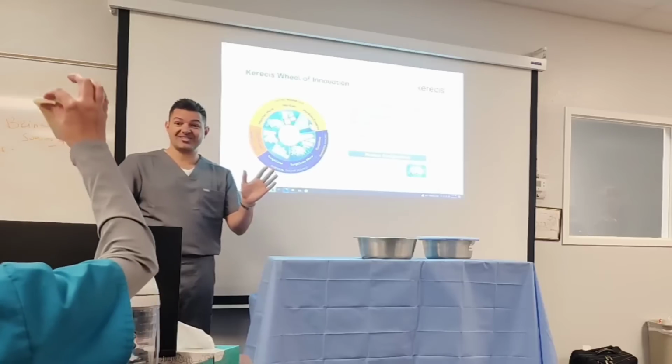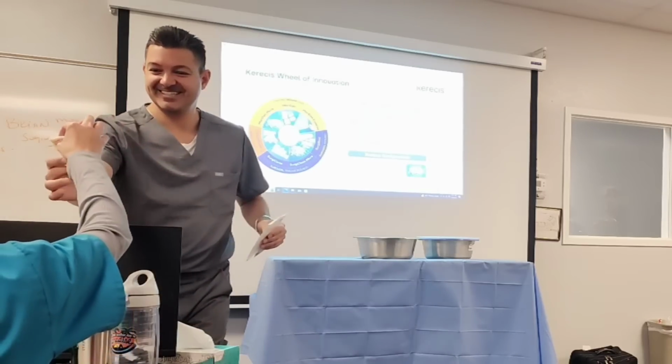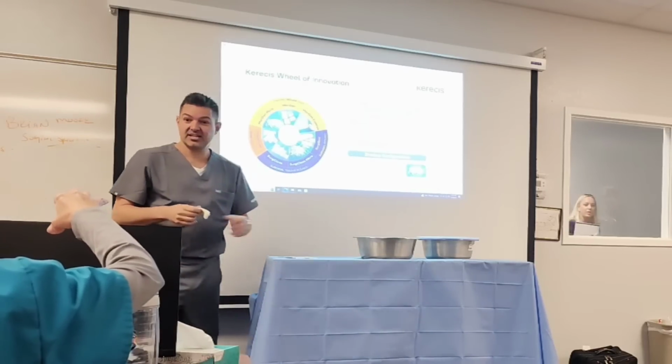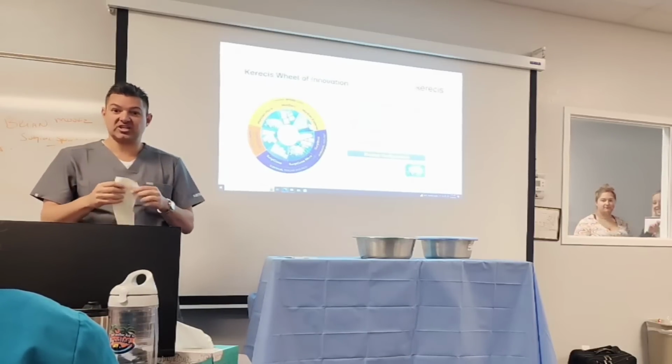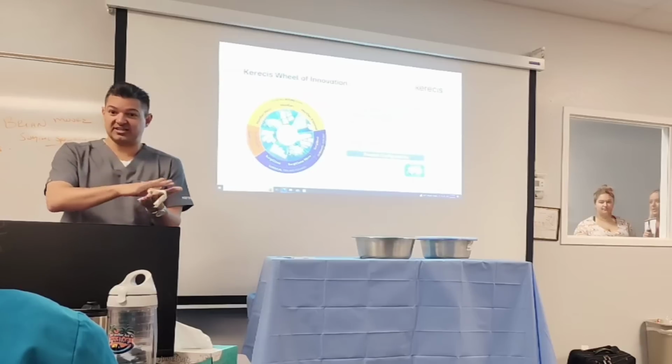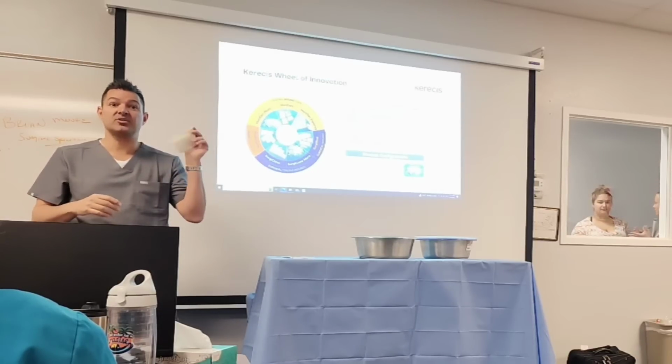Any other questions? What should I do with this? Yes, I'll take it. Is that all fish, or is there anything else added to it? Fish skin? No, this is just strictly codfish skin from the underbelly. That's it. So it's the epidermis and the dermis.